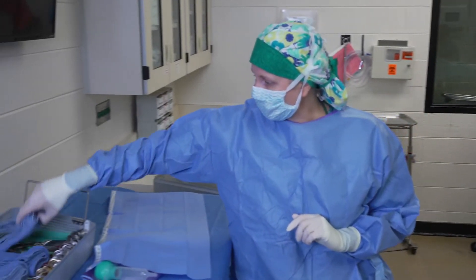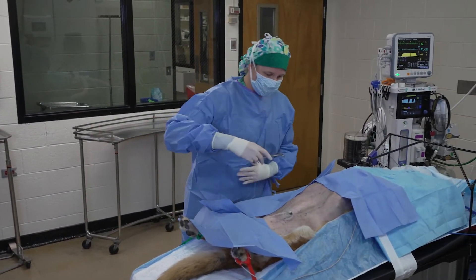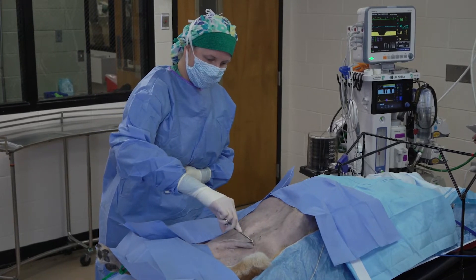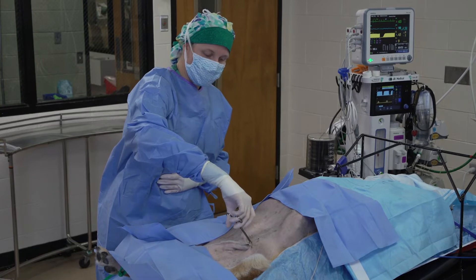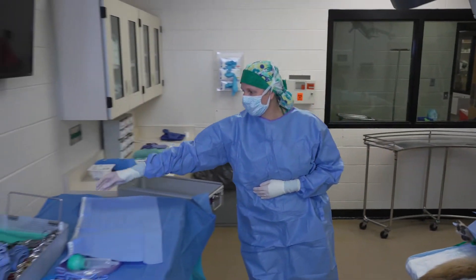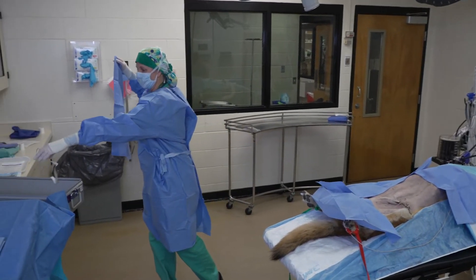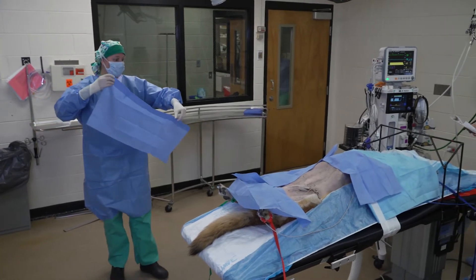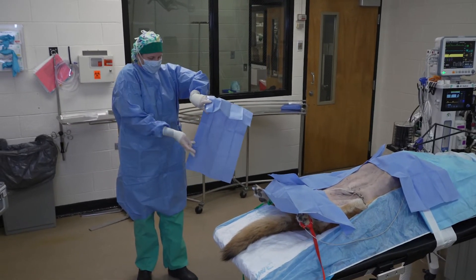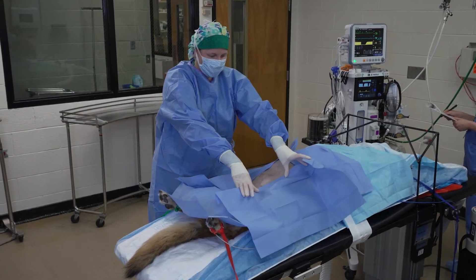Before I do this next drape, I need to drape out the prepuce. I'm doing it now because I have a little bit of a barrier here. I'm going to grab the tip of the prepuce with the towel clamp, then lateralize the prepuce, open up the towel clamp, and pinch a little bit of that skin in. Then I'm just going to drop it — I don't want to touch it. Now I can put my final drape on and drape out the tip of that prepuce, since we don't need it for this portion of the surgery. If we were doing a urinary surgery, we may want to keep that in our field.